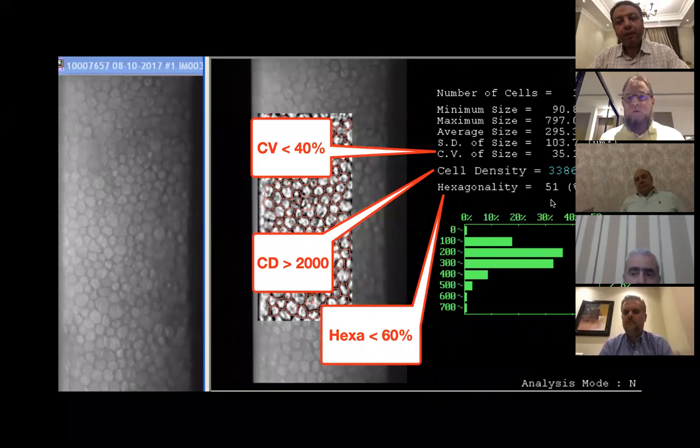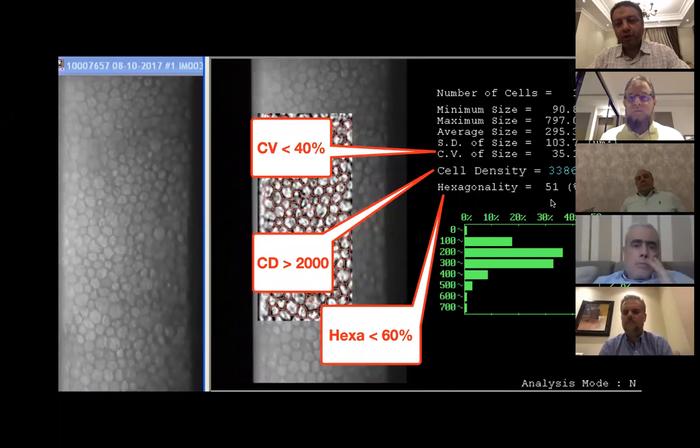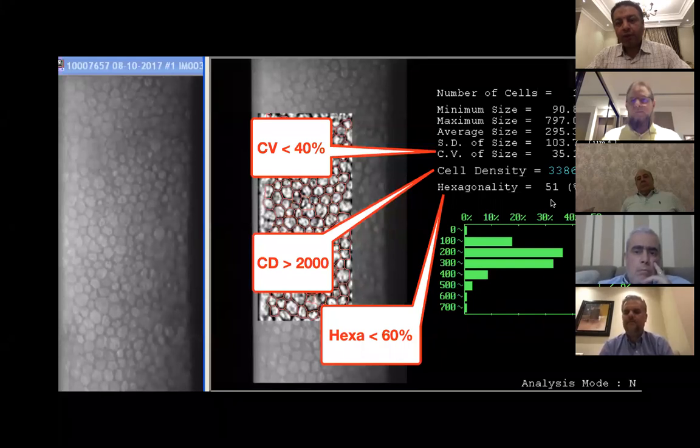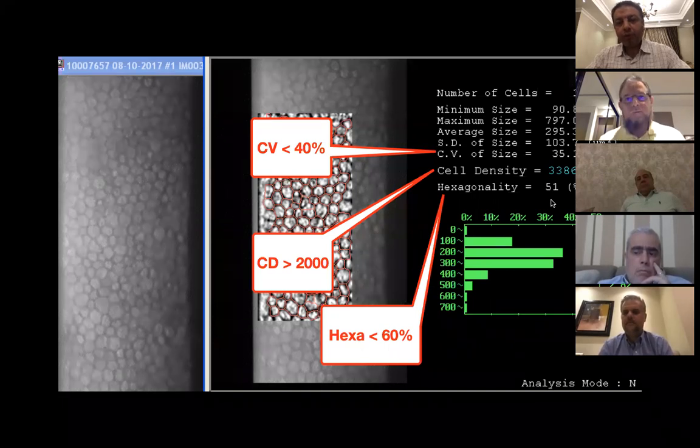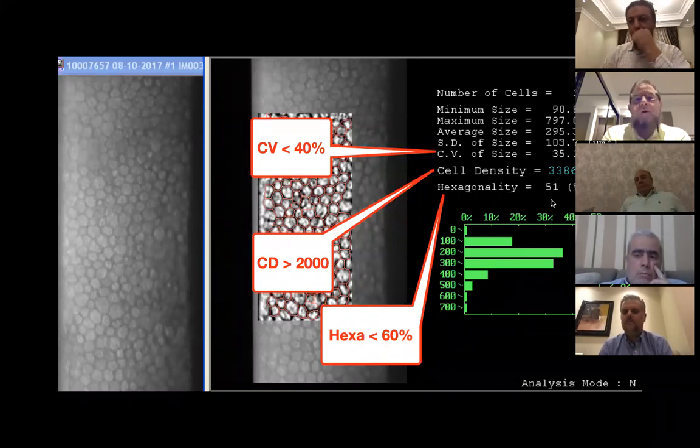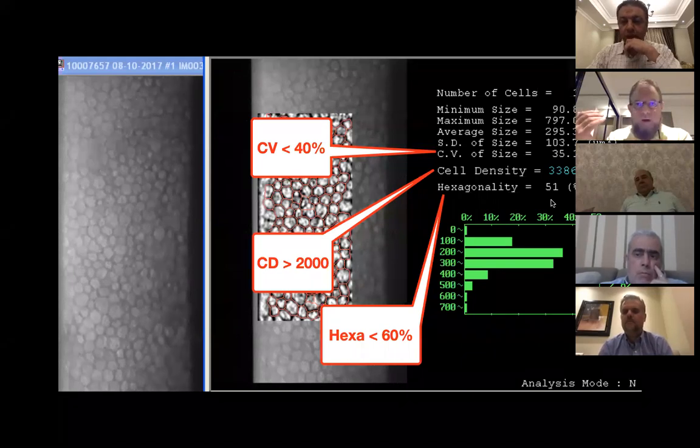If we are doing phakic IOL, yes, for follow-up, to know if there is an impact on the corneal endothelium after a time with the phakic IOL, and what's the time expected to find the changes after the surgery? That these changes are permanent, not transient ones. What time has to pass after that? Did you get my point? Yeah, when to say that now we have to remove the phakic IOL, you mean? Yeah, the time.